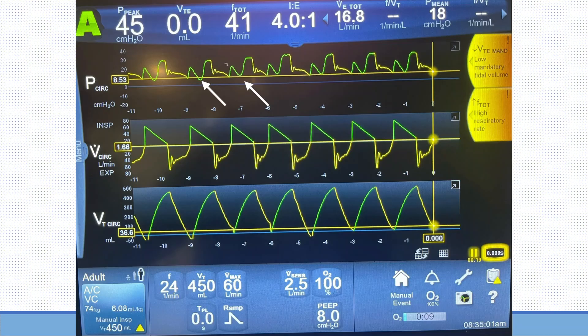What we have here is pressure over time, flow over time, and volume over time. Anything that is green is inspiration on this ventilator; anything that is yellow is expiration. Let's take a look at the pressure over time.